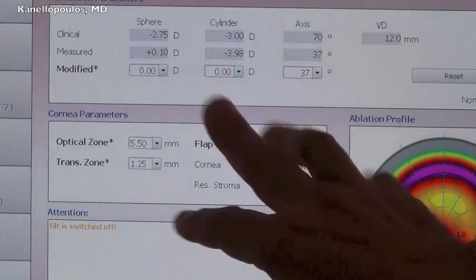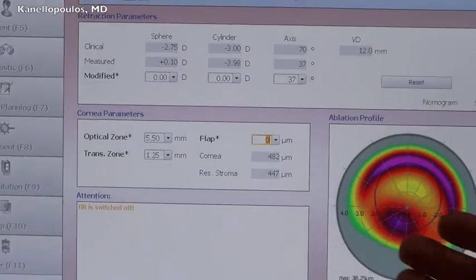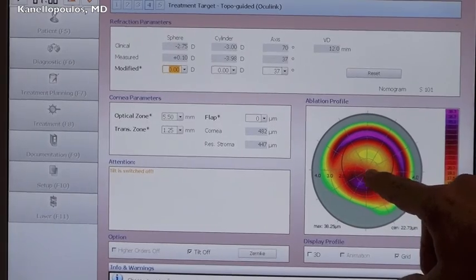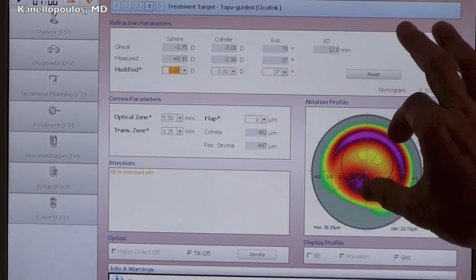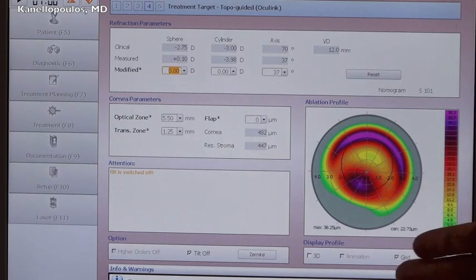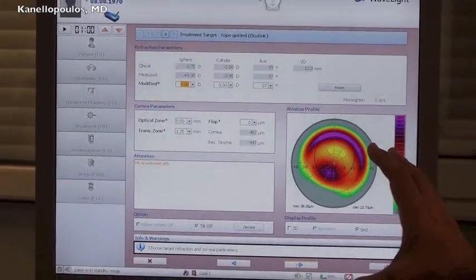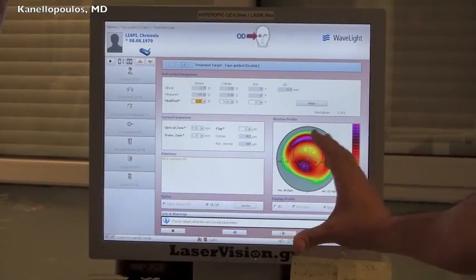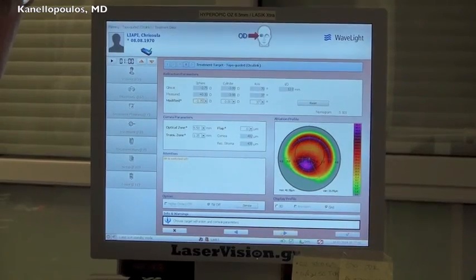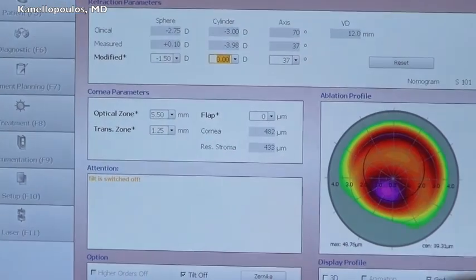And we're going to try and tickle a little bit the myopia and the astigmatism to a degree that will not thin this cornea under 400 microns. So let's do this. We have to keep in mind that since this cone is not central, it's quite oblique. This ablation will steepen the paracentral cornea and might induce myopia. So in this case, since a lot of the astigmatism has been taken care of, I'm going to spend more energy on treating myopia and less cylinder. So we're going to do maybe 1.5 diopters of myopia, and then we're still at 433, and then maybe do a diopter cylinder.